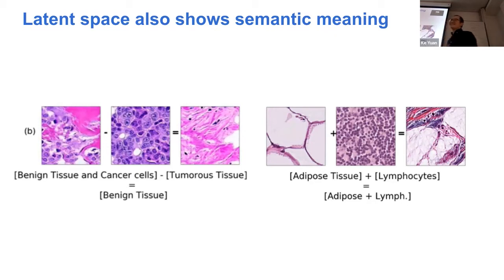Are there some inherent dimensions to this? If there is a manifold in there, are there dimensions that go from one end to the other, benign to malignant, and another dimension from low lymphocytic density to high lymphocytic density, and another dimension to do with necrosis or whatever? Are there any biologically related dimensions here that could be manipulated? Because that would make it really, really interesting. Yes, I agree.